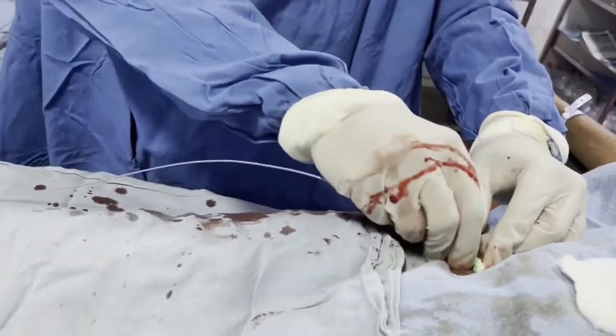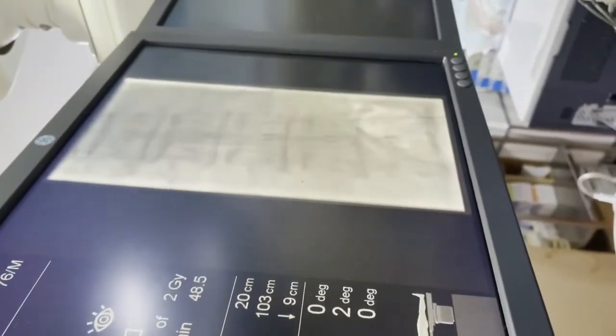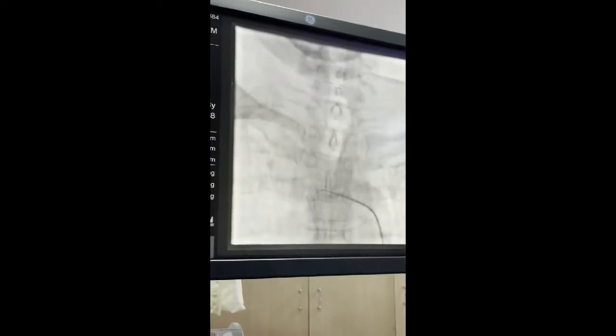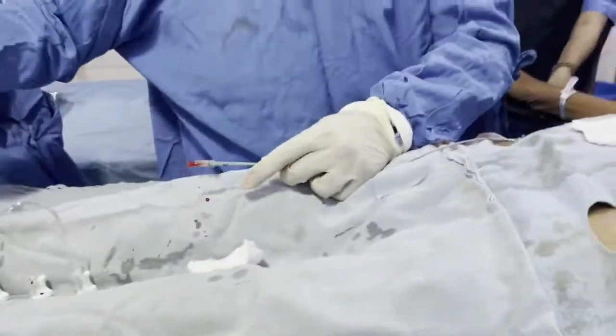We insert the five French Judkins-Right catheter — or we can use a Simons catheter — to cannulate, based on the age of the patient and the tortuosity expected. It is not just the catheter being introduced; the wire should always go ahead in a DSA, about 10 to 15 centimeters ahead, otherwise it will act as a dagger. You can see the fluoro image where the wire has gone in front and the catheter is following. After reaching the arch, I torqued or twisted the catheter and it went directly to the right common carotid artery.